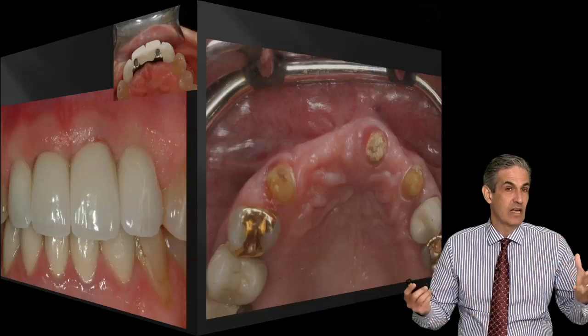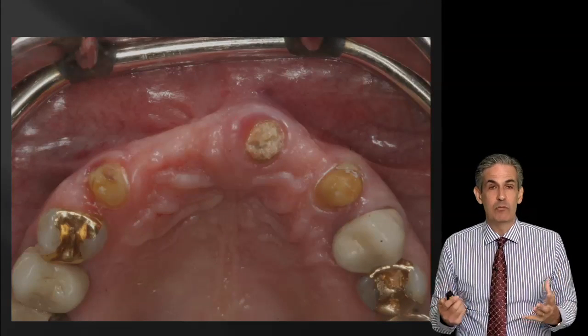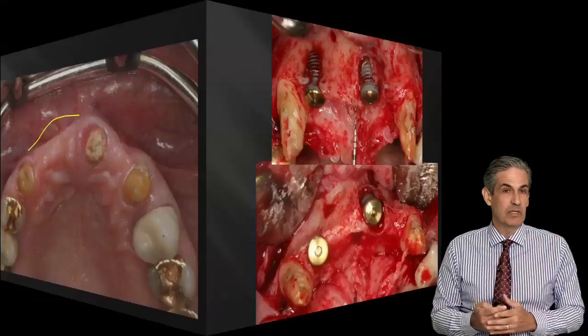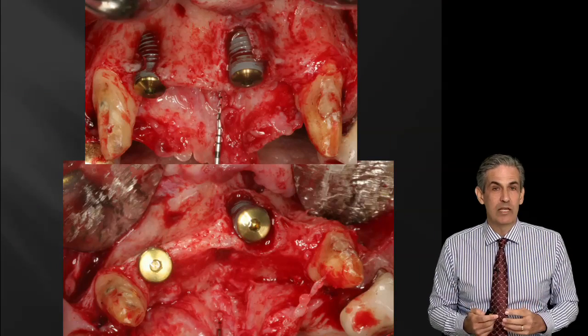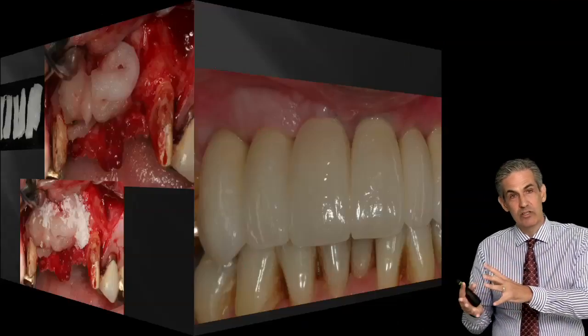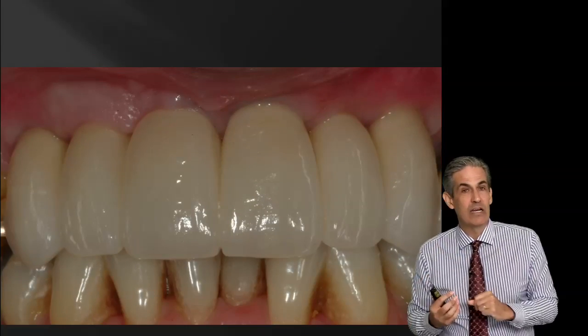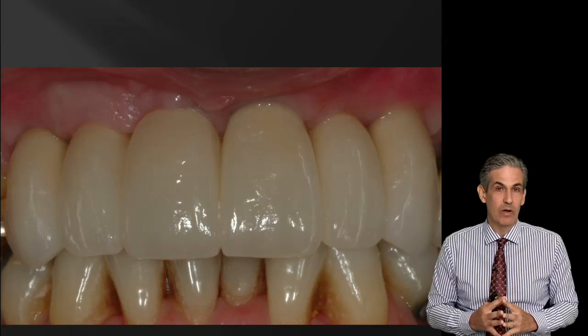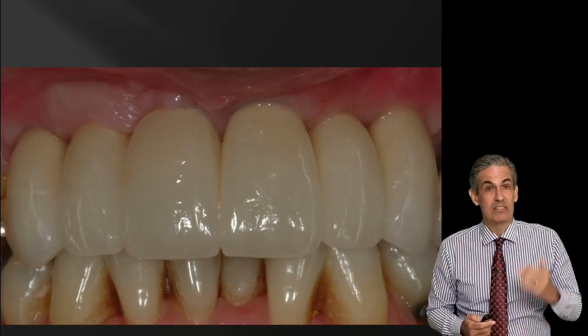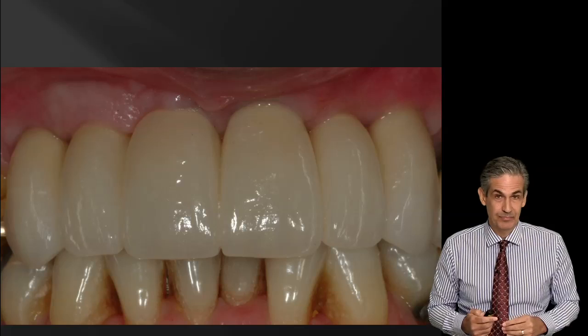Here's a case that Sasha did, and amazing bone loss, but using bone morphogenic protein with implant placement and really minimal bone, was able to achieve really a spectacular result. So here we have this great synergy between surgical management in really a spectacular way, and then restorative, really it was actually fairly straightforward because the implants were placed ideally.